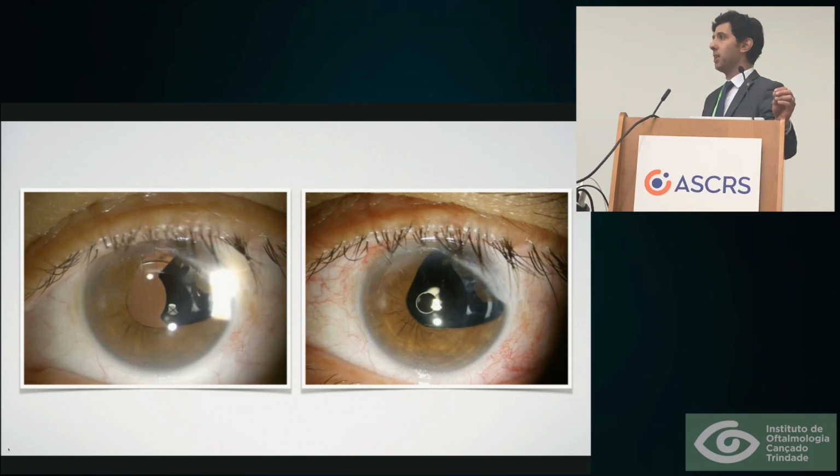When we examine patients in the slit lamp, we tend to believe that most pupils are the same and they behave the same. We're examining in a setting of high illumination and the light source is very close to the eye, so pupils tend to react a lot and they all become small. And this leads to an underestimation of the power of a pinhole in those scenarios.